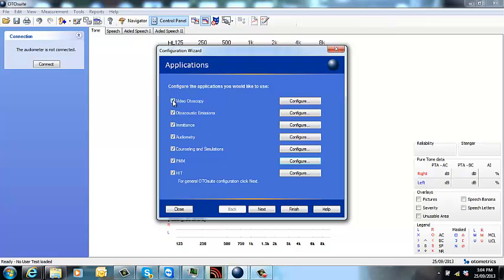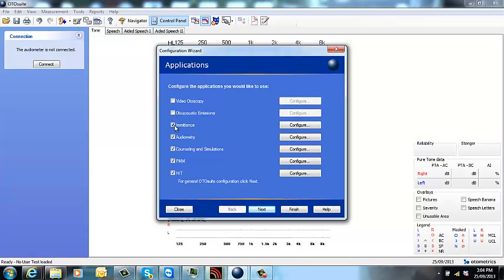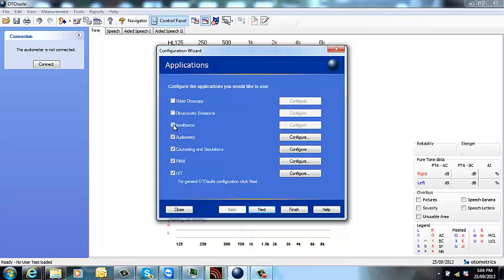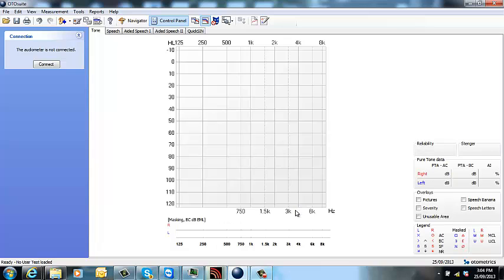Now if you don't have the video otoscope, Cappella, OtoPlex, you can untick these extras if you've just got the Oracle. You just want audiometry, counselling and simulations in PMM. And click finish.